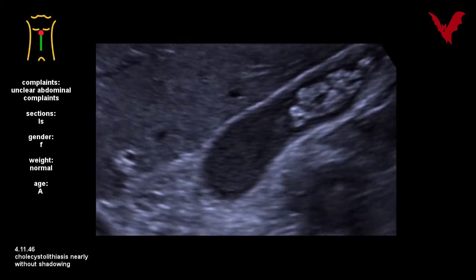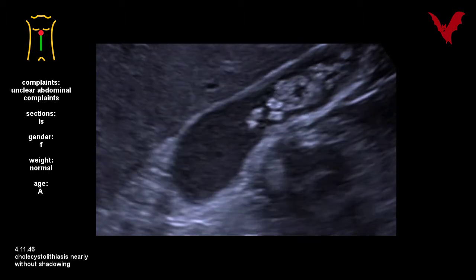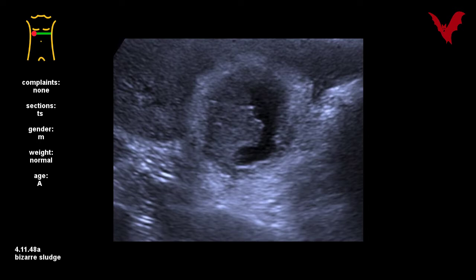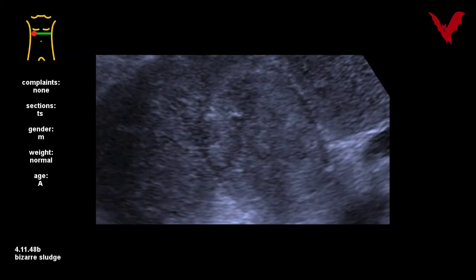A clip after laparoscopic cholecystectomy and a migrating bullet from World War II are displayed in figures 45 A and B. In clinical US, they were misinterpreted as stones. Sludge and stones filled gallbladder without major shadowing is seen in figure 46. Asymptomatic were these two different cases in figures 48a and b, despite their seemingly alarming morphology.